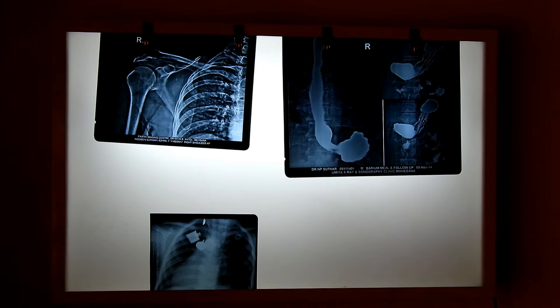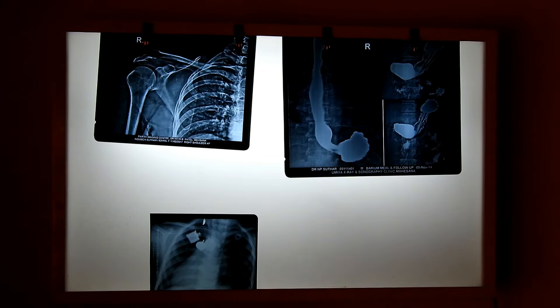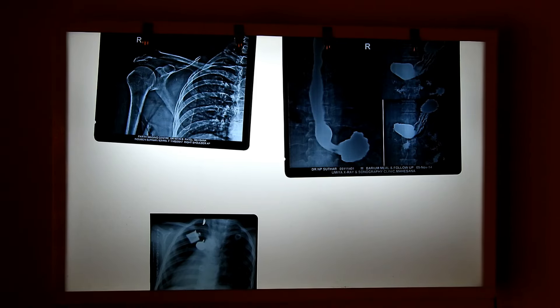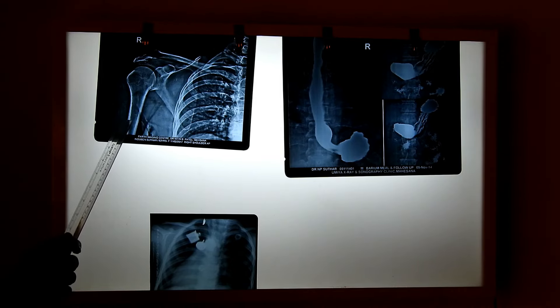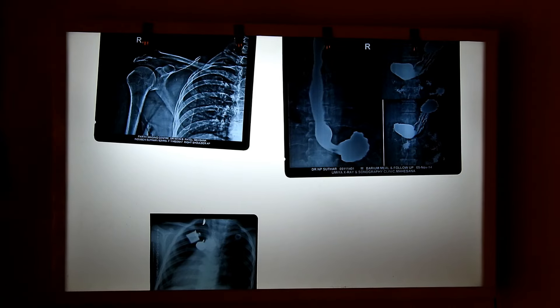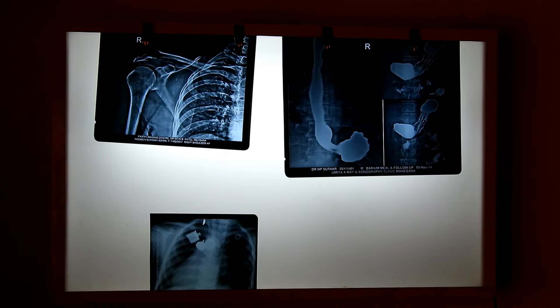In the anteroposterior view, the rays come from the anterior side and focus on the radiological plate placed on the posterior side. Here is the AP view of a shoulder region, where rays come from the front and fall back on the plate. In this X-ray of the thorax, the reverse posterior-anterior view is taken.